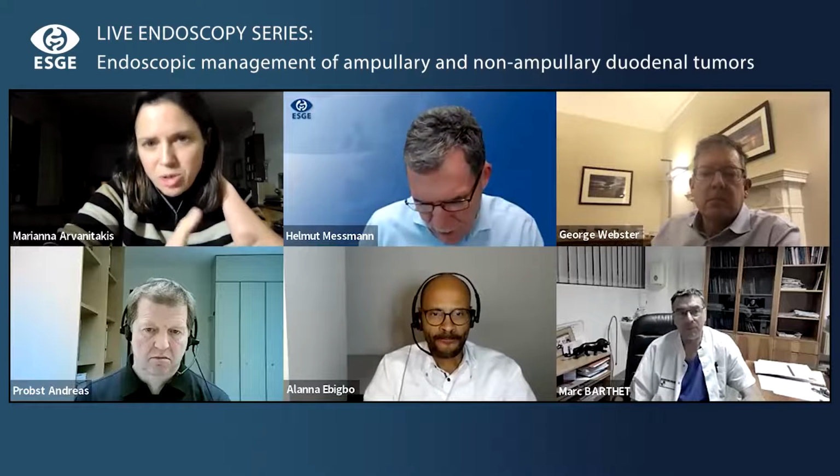There's an interesting question about if we can survey small lesions of the ampulla of under 1 centimeter, I suppose low-grade dysplasia. I would say that we still have time to survey these lesions, especially in patients that are unfit for surgery for endoscopic resection, in elderly patients. I would say it depends on the age of the patient. The risk for small lesions is not as high. So usually, if I have a young lady, I would resect. But for a 92-year-old lady who is looking like 70 years old, we can also watch and wait, Marc.